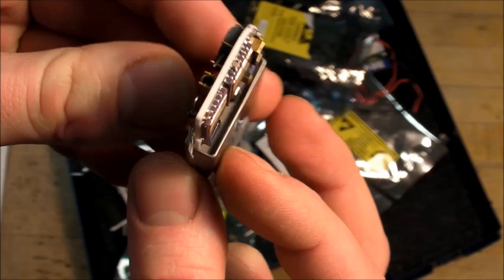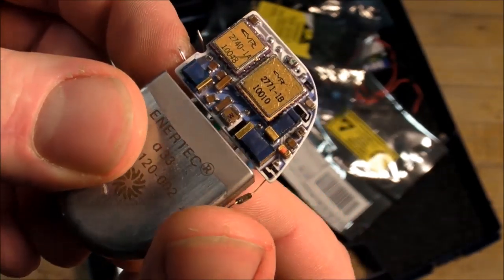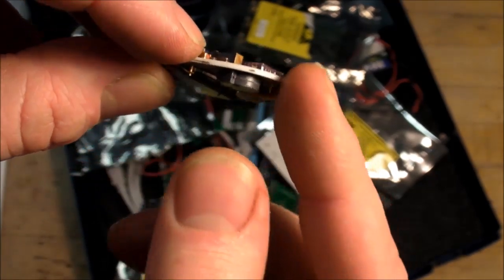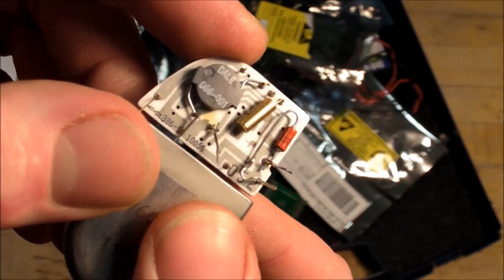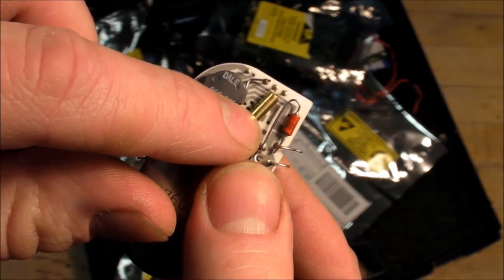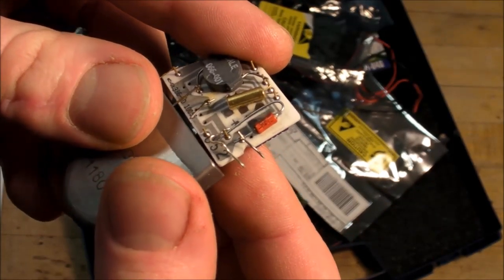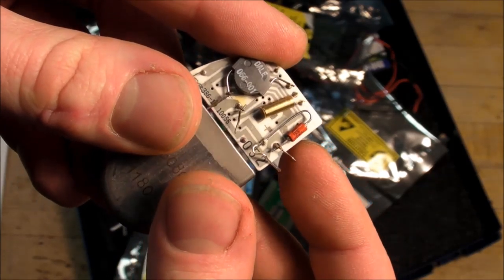We got a lithium battery, supposedly lithium, and some nice top quality ICs there, and a bunch of capacitors, and this is all on a ceramic board. I guess it's just double-sided. That's already measured. That's a 1 millihenry inductor. We got a quartz crystal, and this little orange thing here, that is a transient voltage suppressor. I don't know if you can see the symbol on it right there, but that's what it is.